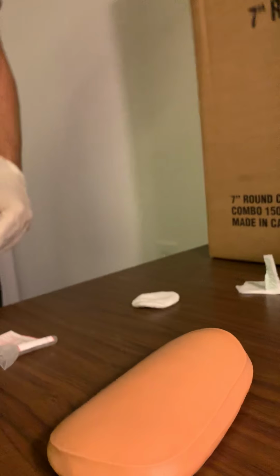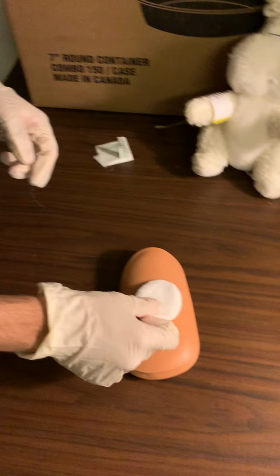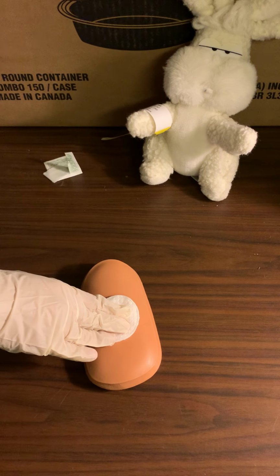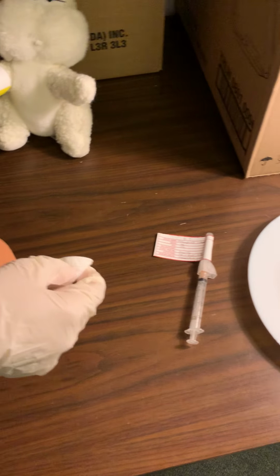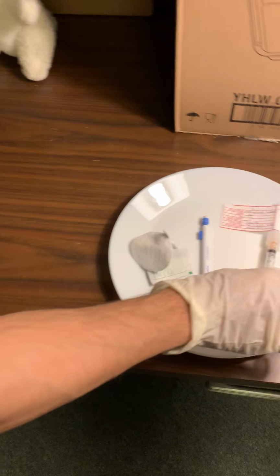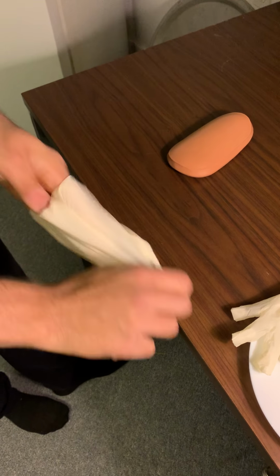And then I will be activating my safety mechanism in a clinical setting, but for right now, I'm not going to be activating it. And I'm just going to cap this, and I would put this in a sharps container where it belongs. I'm going to be putting a cotton ball over where I injected for 30 seconds, just to make sure it doesn't bleed. And let's just say that's been 30 seconds for now. Okay, we can just discard all the garbage that we have, and this would go in the sharps container, like I said. I can take off my clean gloves and toss these too.